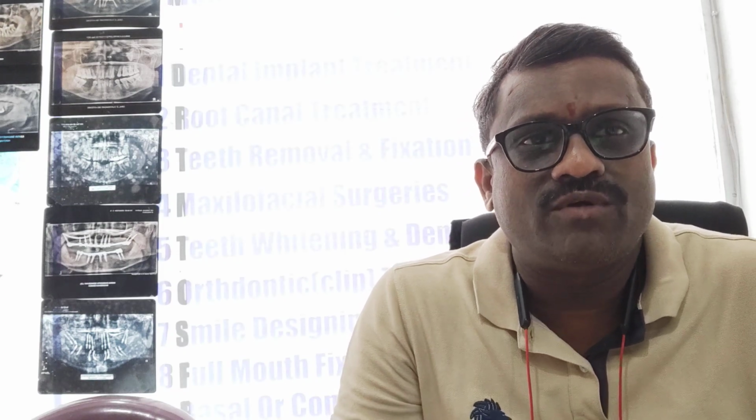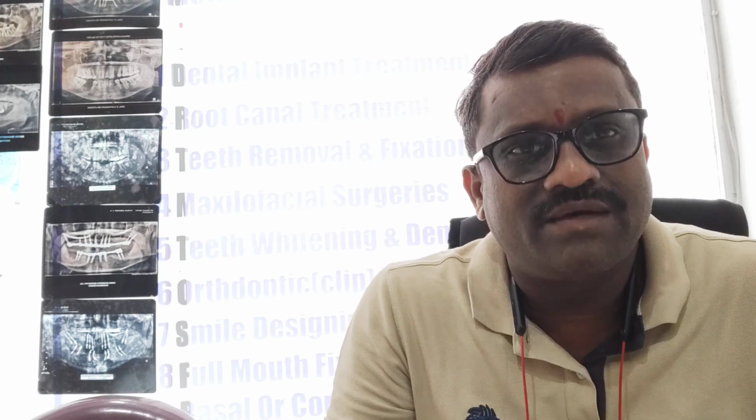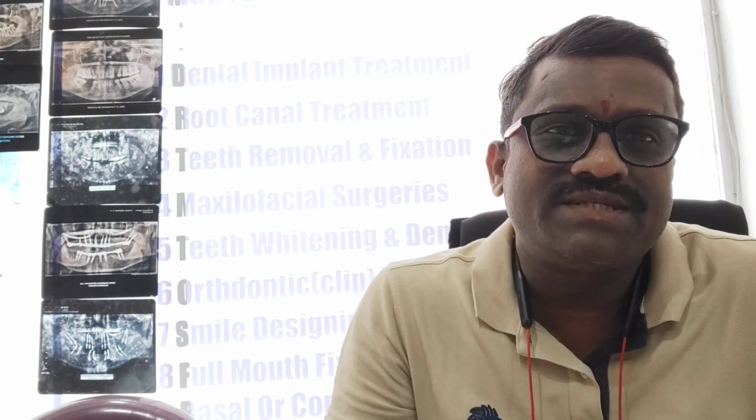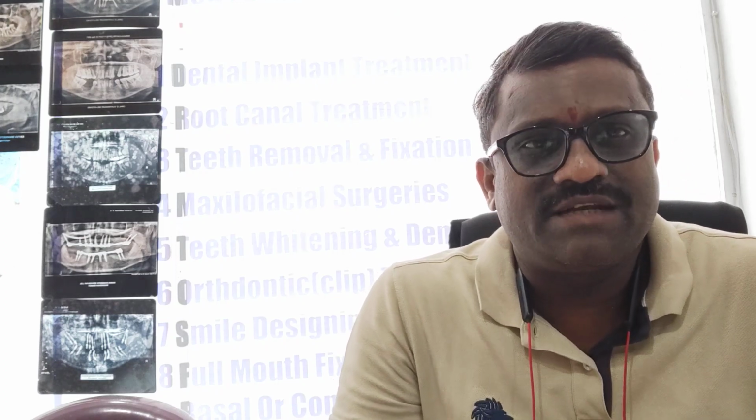So these are the different steps in the conventional technique. We have to follow sequential drilling, whereas in basal implantology we usually follow a single drill technique or otherwise a two drill technique. In the single drill technique, first we analyze the OPG and CBCT and gauge the length of the implant to be placed, for example in the maxillary nasal floor.